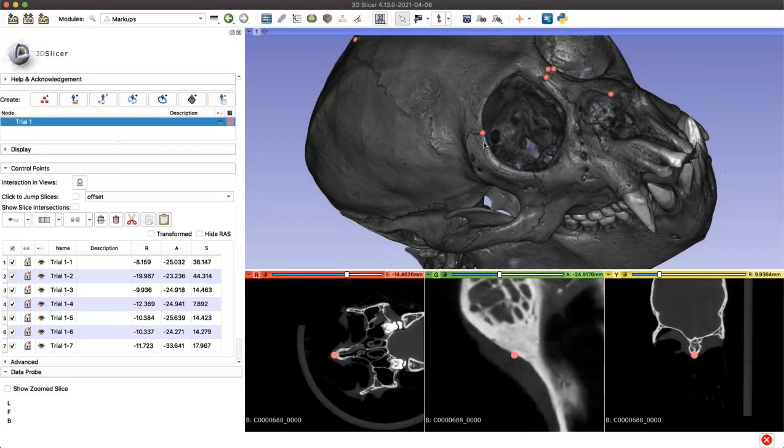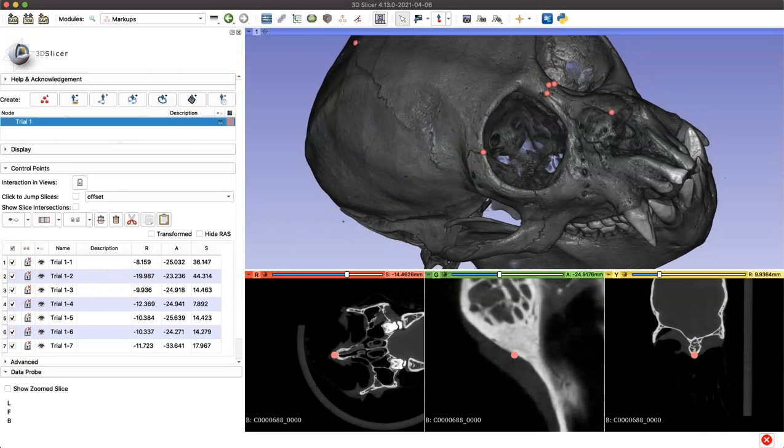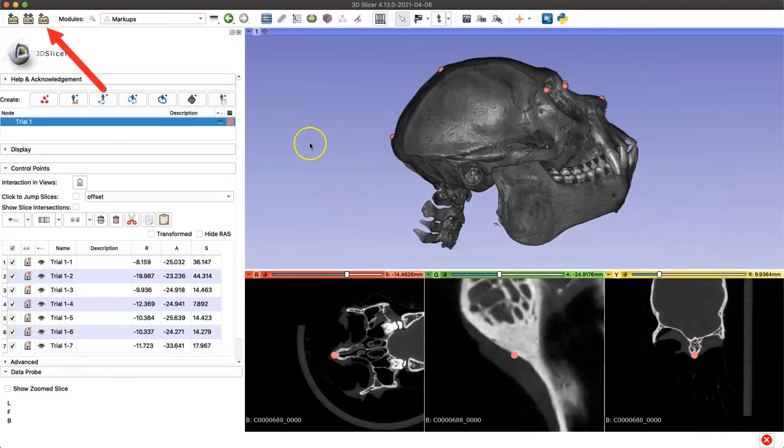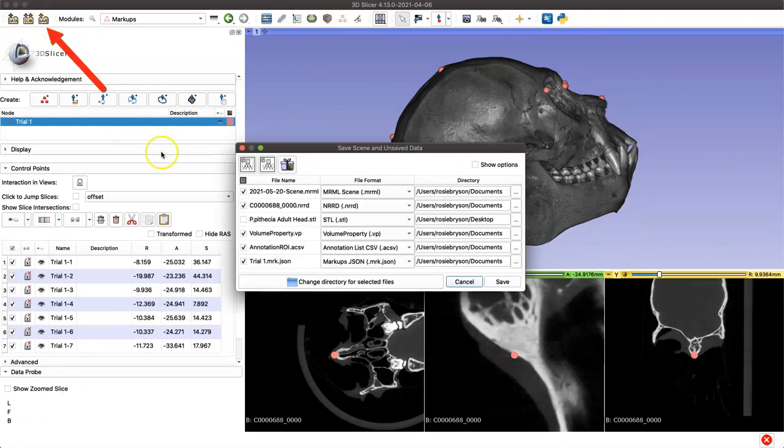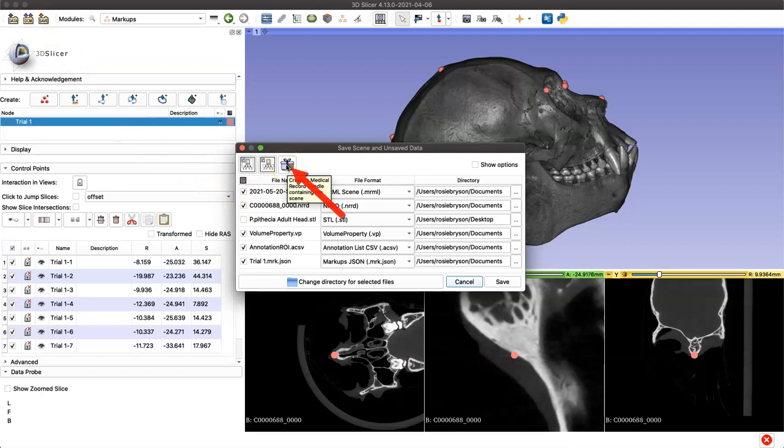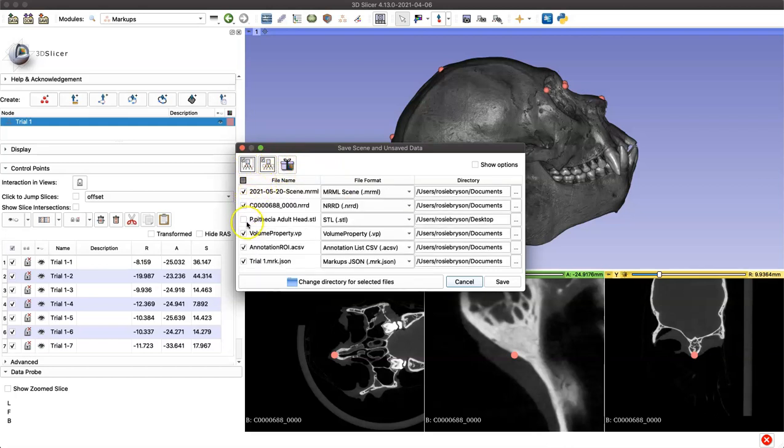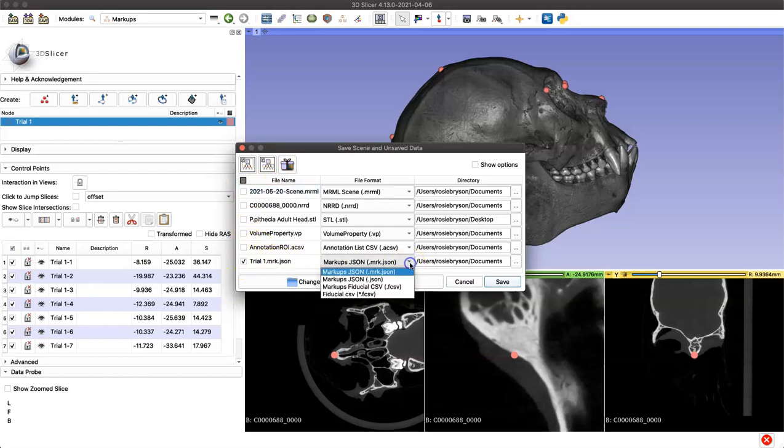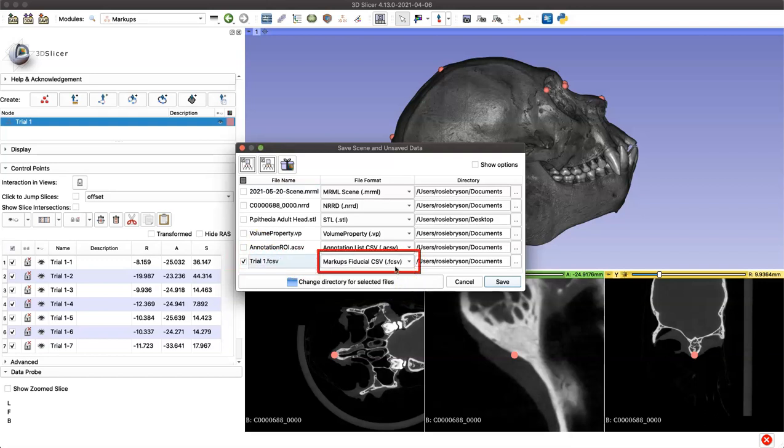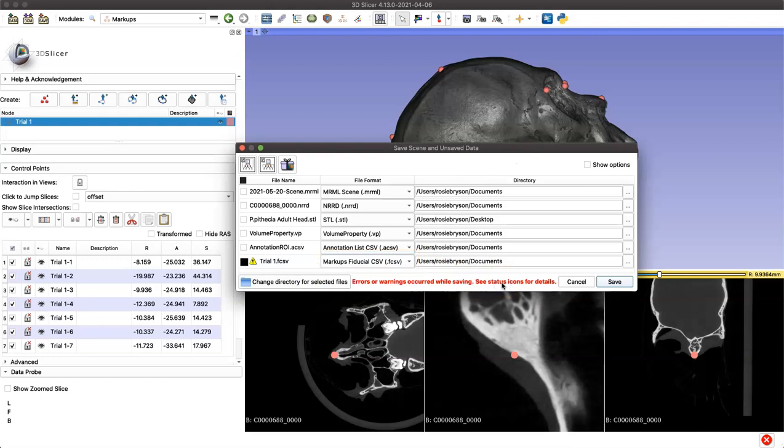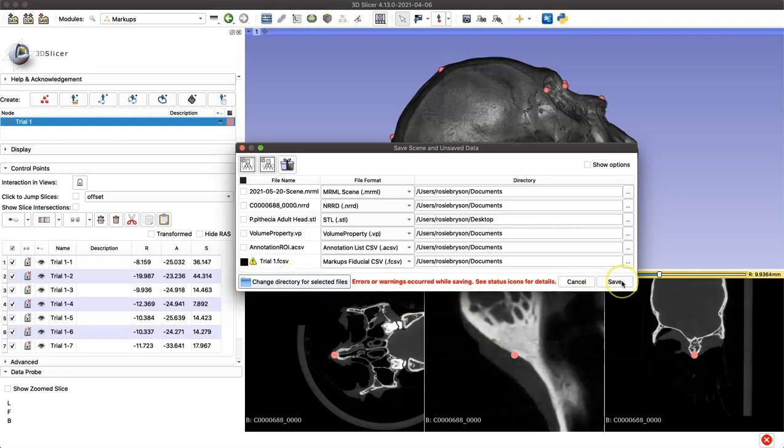Finally, our last step is just going to be to save our landmark data that we've collected. I'm going to click on the save icon. You can either save your whole project in a medical reality bundle by clicking this icon, or you can select just your landmark data, which is here under the name we assigned it, trial one, and make sure you select markups fiducial CSV file format and click save. Ignore this warning if it pops up for you, and make sure that you're saving to the directory that you'd like your file to end up in. And then click save.